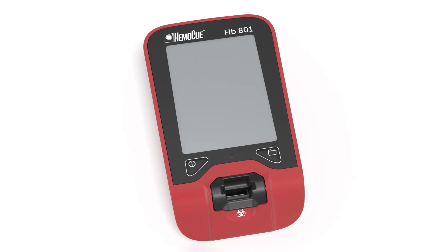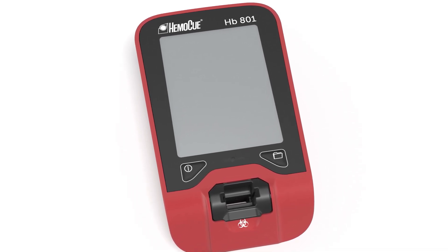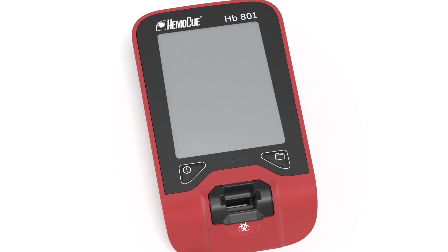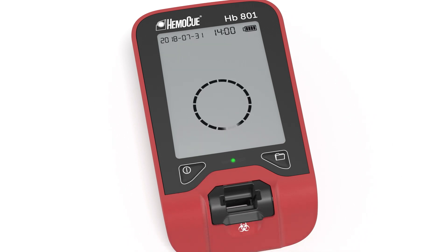To begin setup, place the analyzer on a horizontal and stable surface. Then press the ON-OFF button to the left until all display segments light up. Release and wait until the analyzer is in ready state.